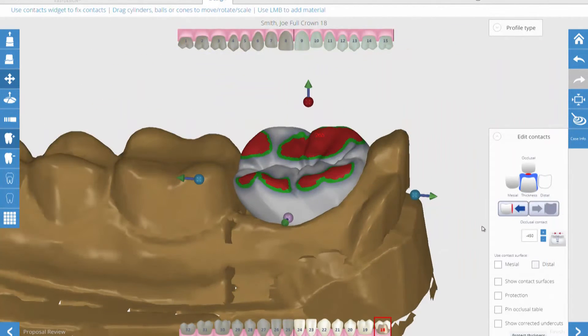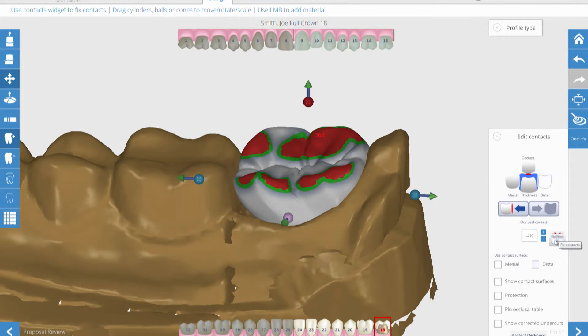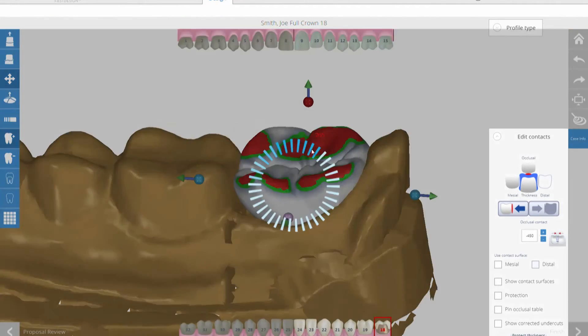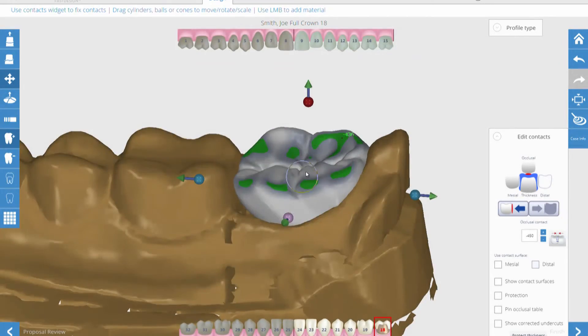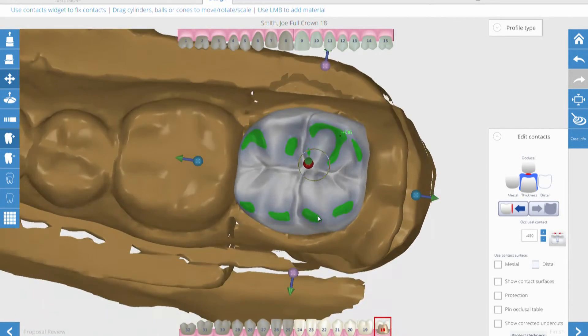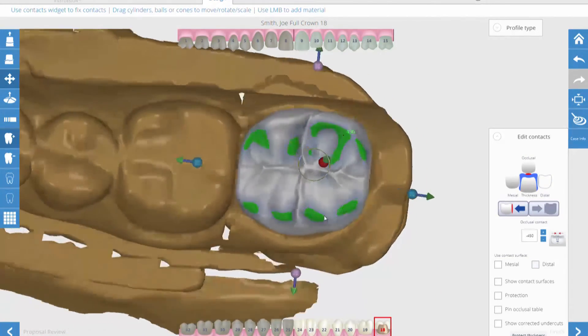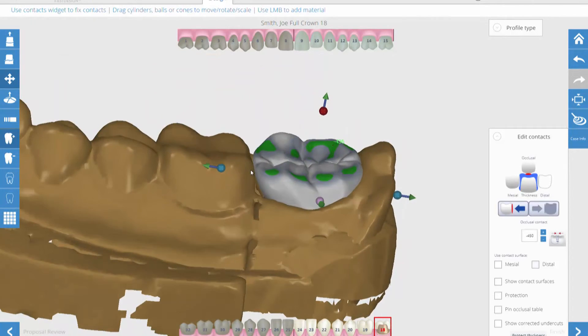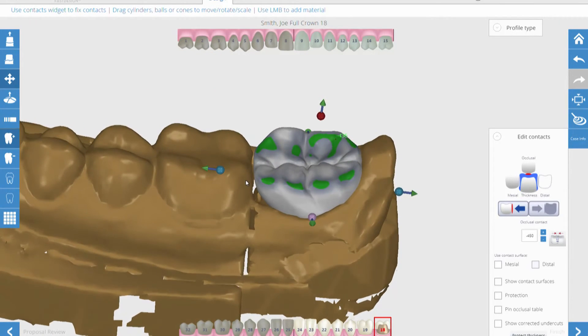There are two key features that stand out in the Fast Design software: occlusion and contact editing tools. Both allow you to set a specific number in microns for the desired occlusal clearance and contacts and apply them in one click.